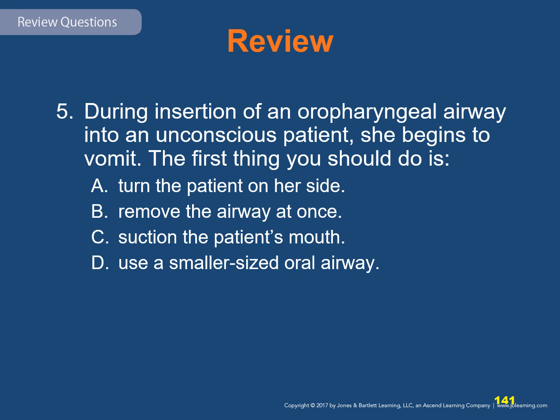During insertion of an oropharyngeal airway into an unconscious patient, she begins to vomit. The first thing you should do is A, turn the patient on her side. B, remove the airway at once. C, suction the patient's mouth. Or D, use a smaller sized oral airway.